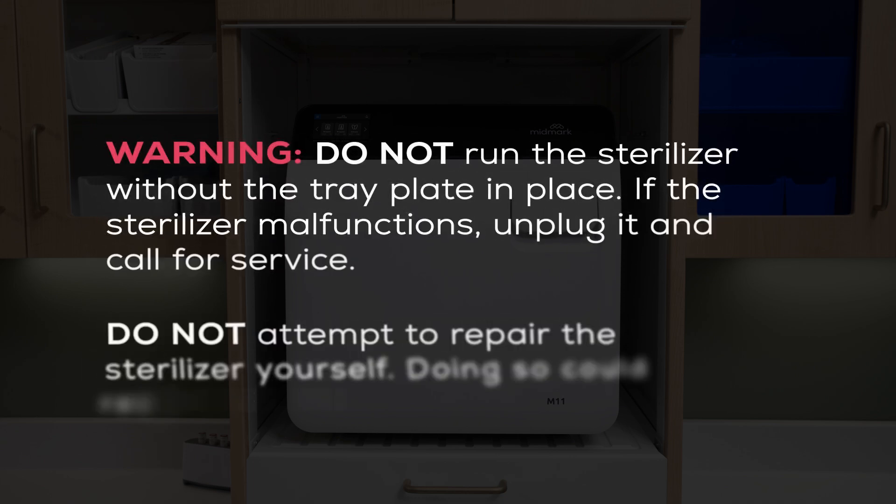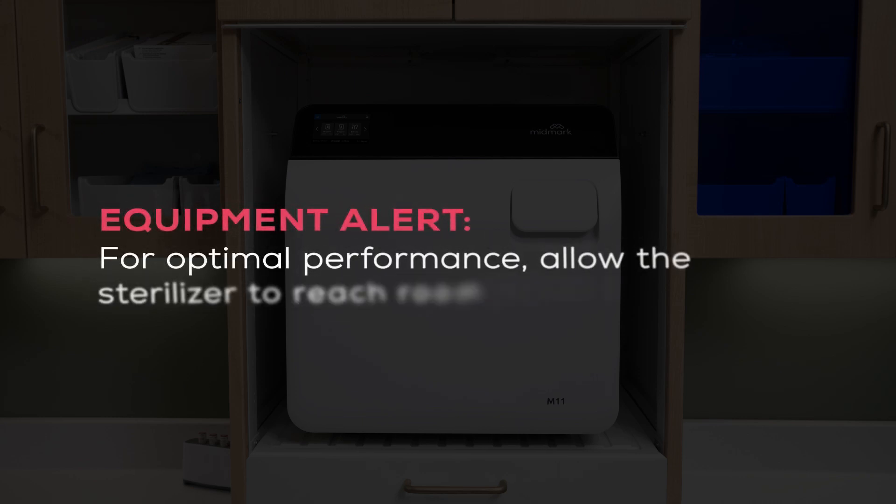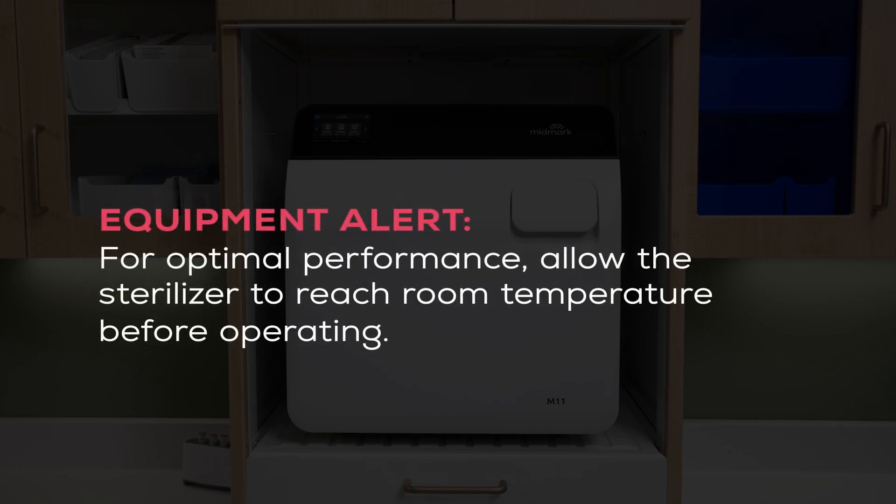Do not run the sterilizer without the tray plate in place. If the sterilizer malfunctions, unplug it and call for service. Do not attempt to repair the sterilizer yourself. Doing so could result in serious injury. For optimal performance, allow the sterilizer to reach room temperature before operating.